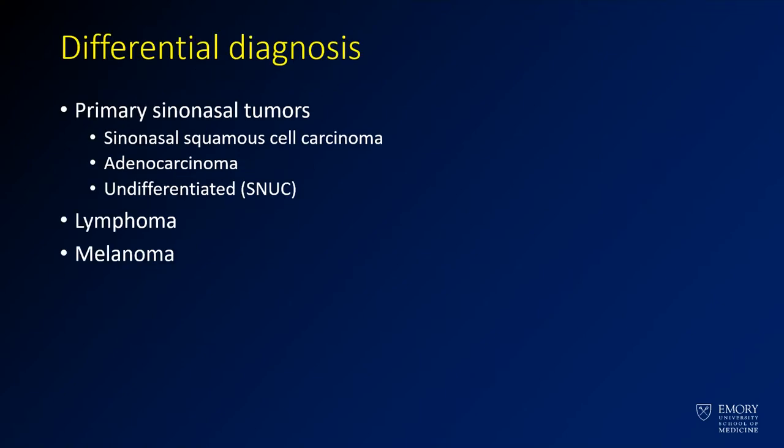The differential diagnosis for these masses — you can't always just call them esthesioneuroblastomas, although that's a classic description. You really have to think about primary sinonasal tumors, particularly squamous cell carcinomas, which are probably vastly more common than esthesioneuroblastomas. Lymphoma, melanoma, and metastases can have a similar appearance.